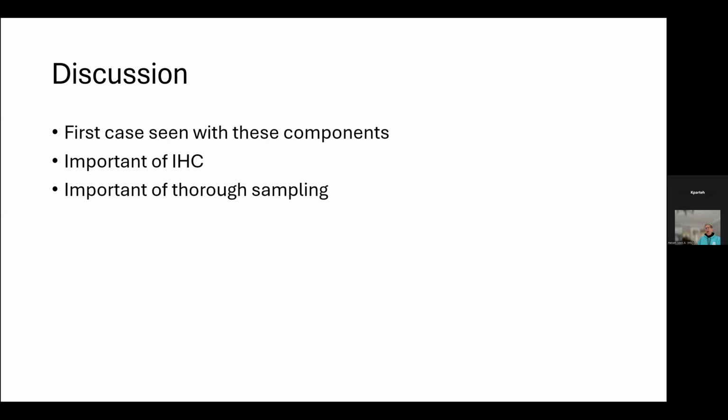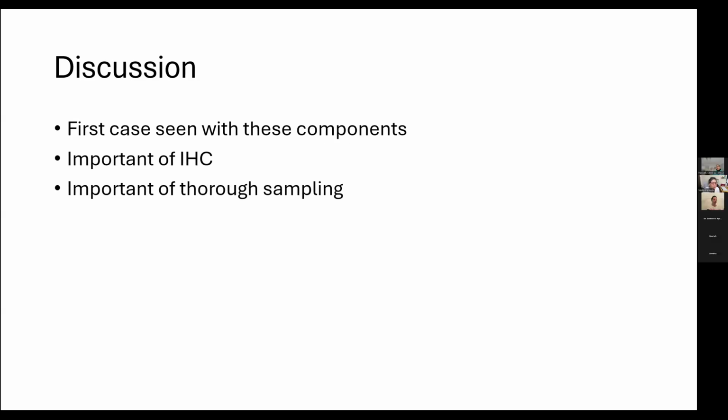Then the question of evaluation for immature teratoma with the small blue cells is a very interesting question, because I've seen a number of instances where people will see things that they think are neuroglial elements that are not, either because they see something that looks a little bit like a rosette, or in this case, because you have what appears to be lymphoid tissue with germinal centers that could be mistaken.